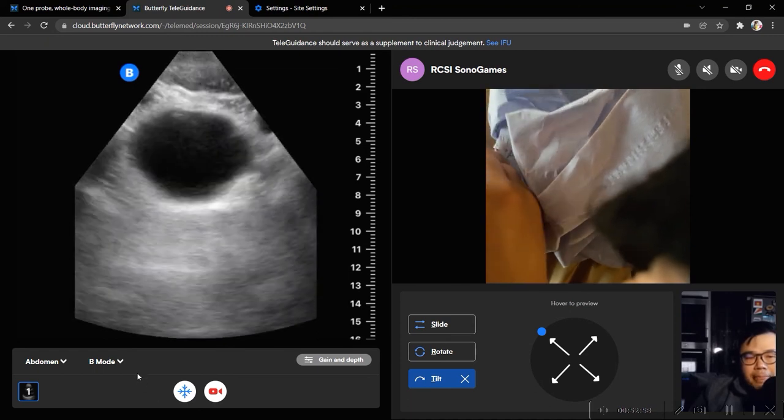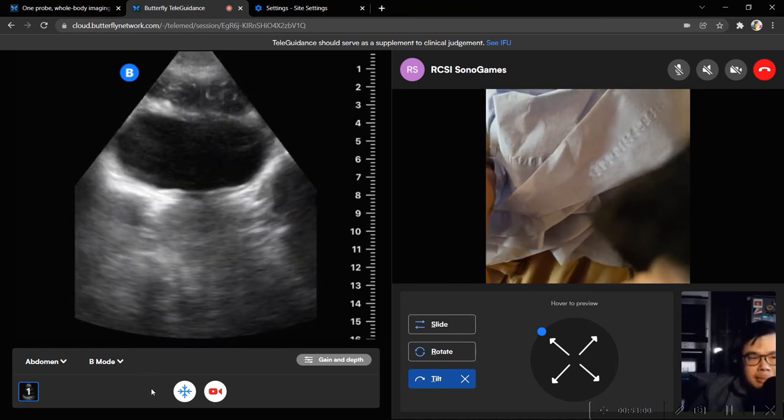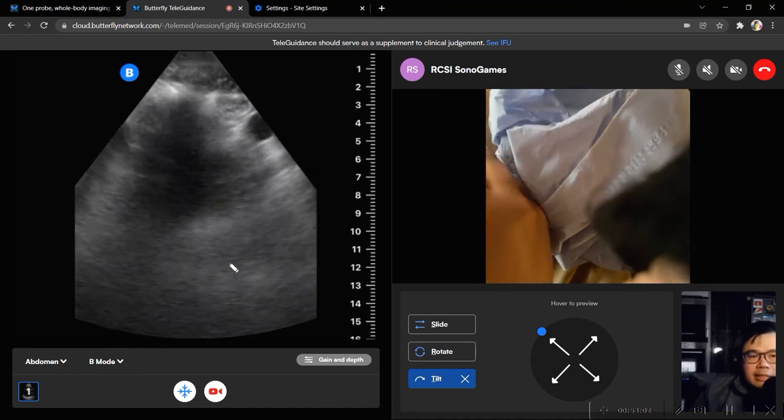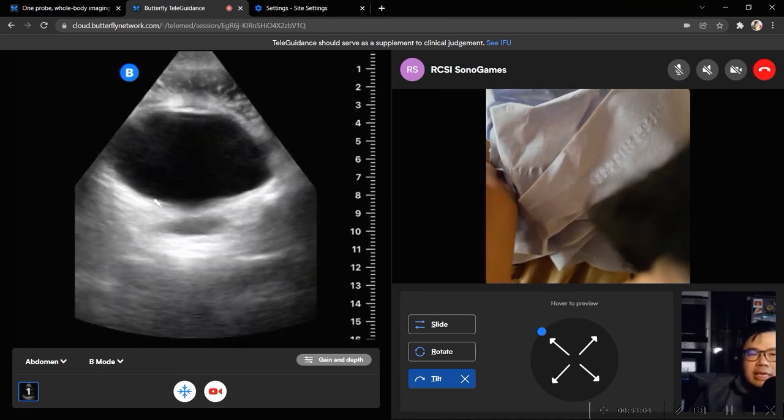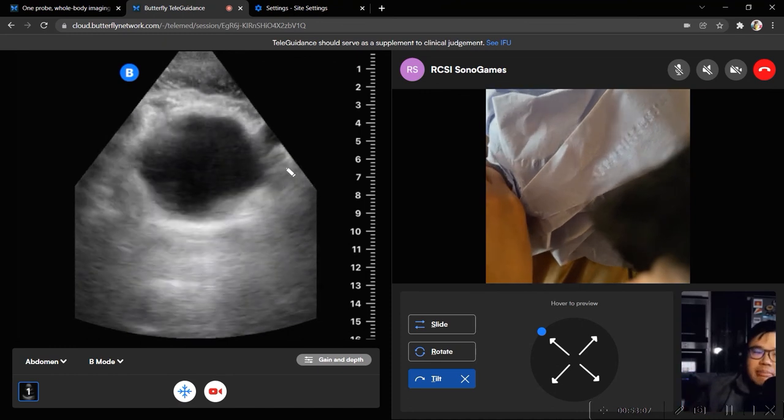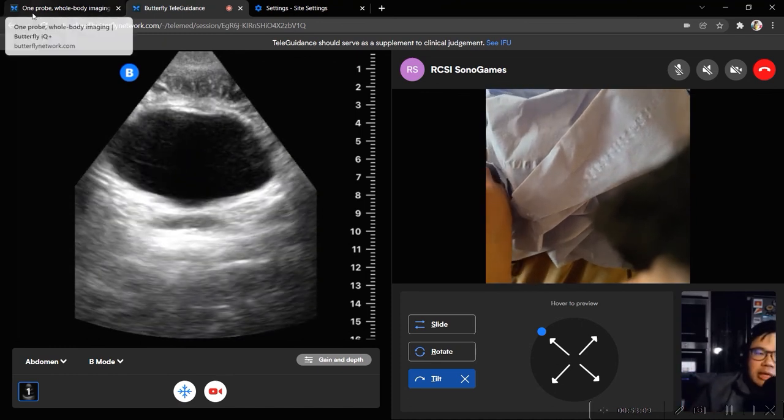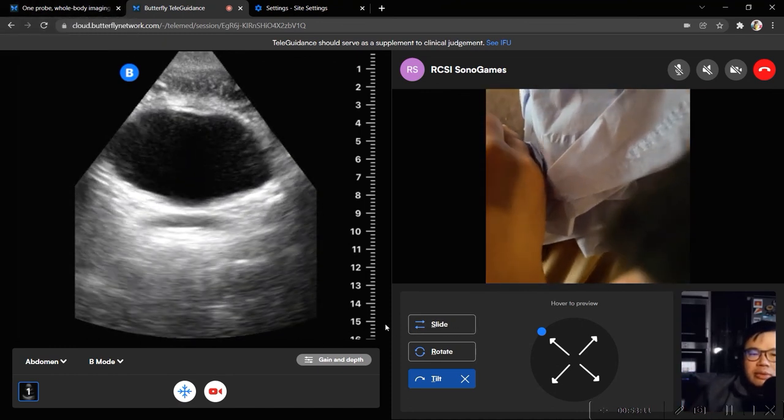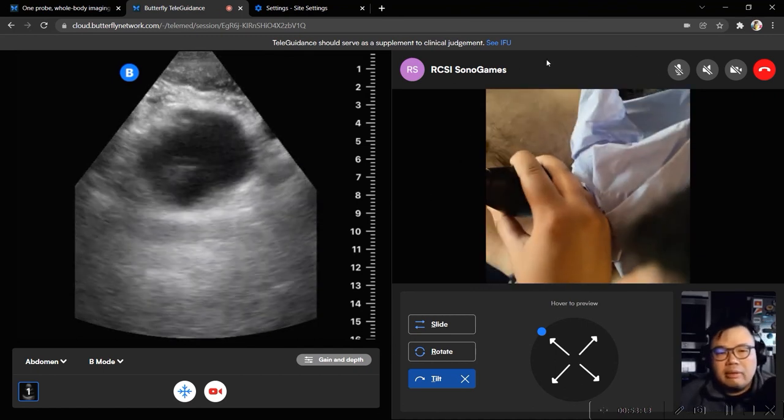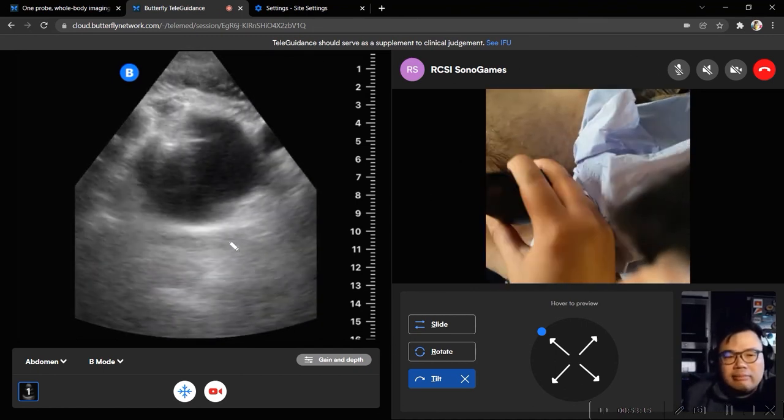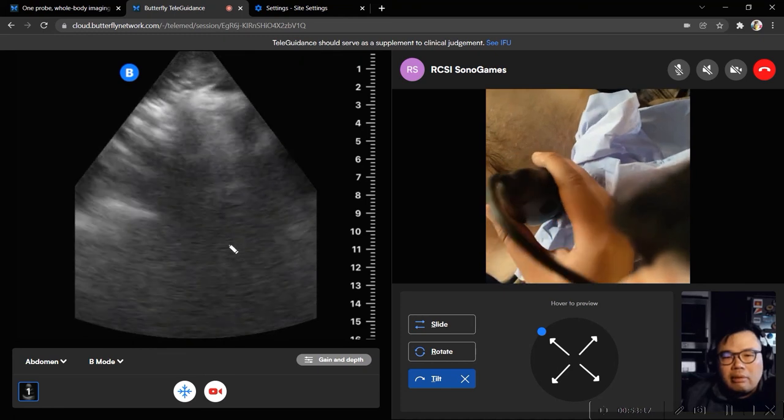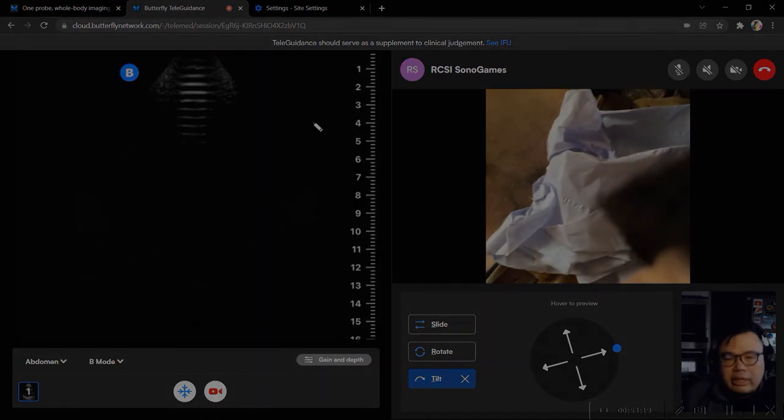Do I turn, like, up and down? You do? Yes. So you're kind of like getting a 3D impression of a... Well, you're getting a 3D impression because you're only using a 2D image, really, to view this. Excellent. Good job. All right. Then it moves to the right upper quadrant. Left upper quadrant.